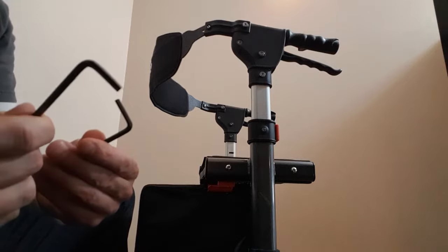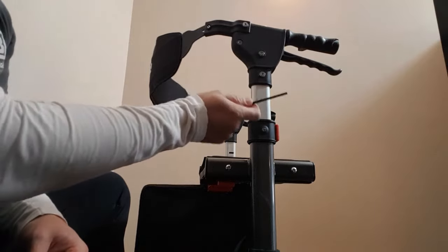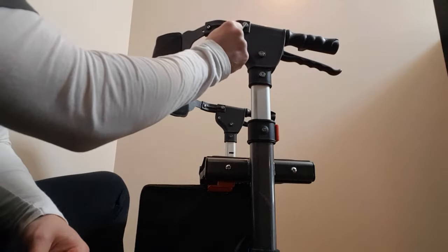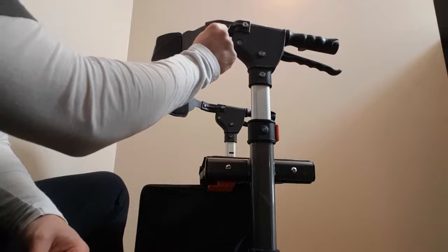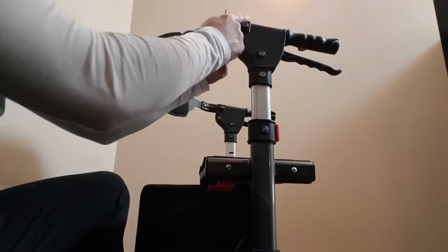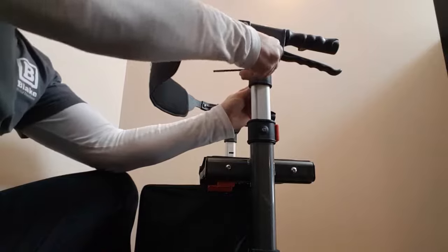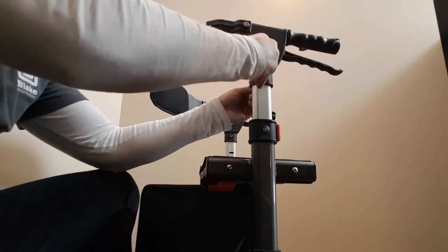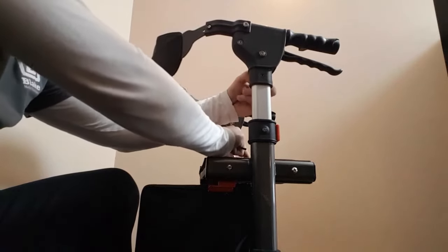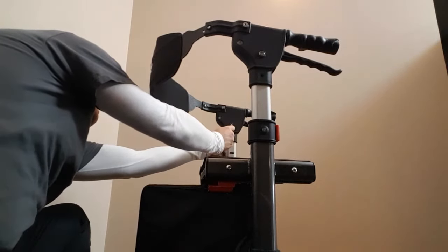I grabbed a couple of 5/32" Allen keys here, and the adjustments I'm going to make are from these bolts here down to this section here. One thing you want to remember is that because you've got this plastic housing that clamps around these, the bolts are going to be longer. So when we move from this position down to here, we're going to want to put the longer bolts in the lower position and the shorter bolts in the upper position. Keep those close and just repeat the process over on the other side.